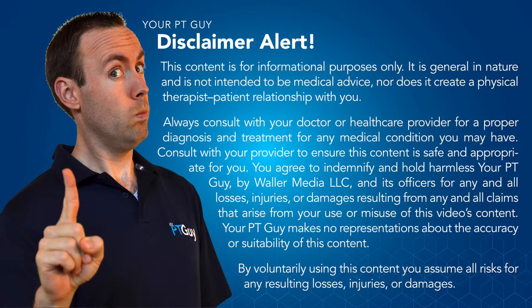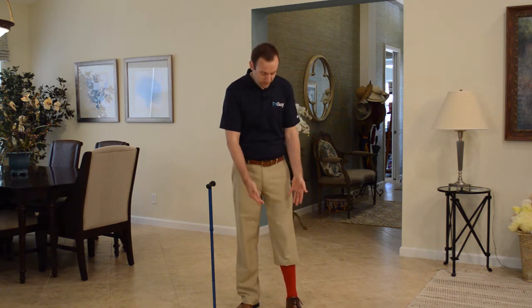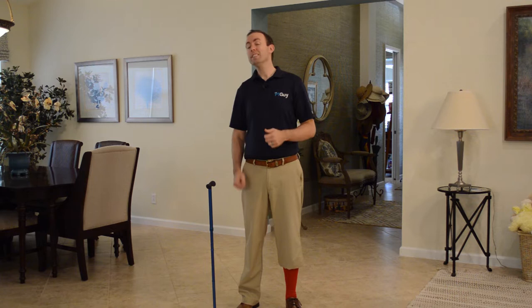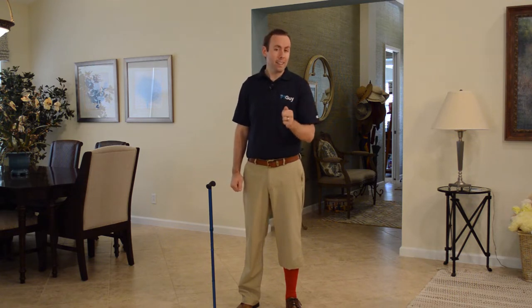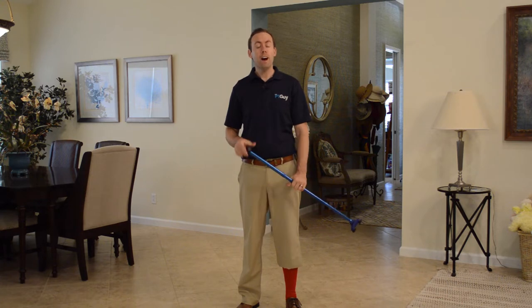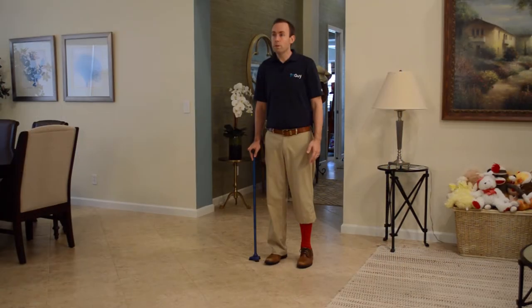In this example, my left leg hurts — it's red, it's inflamed, it's aggravated, it hurts. I can take pressure off of that leg using the cane when I'm walking, if I know the right technique. Let me show you how to do that.